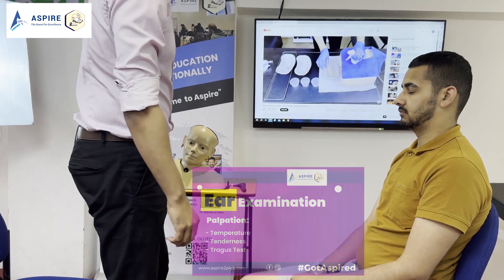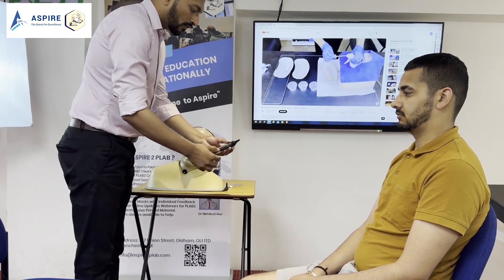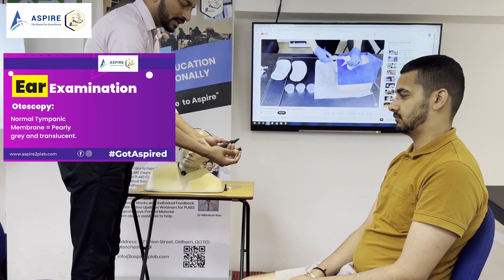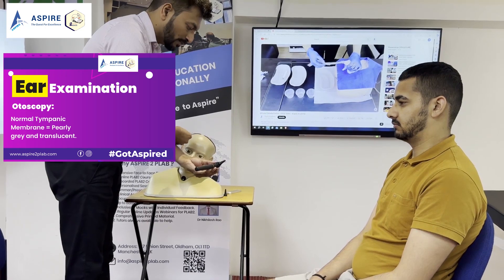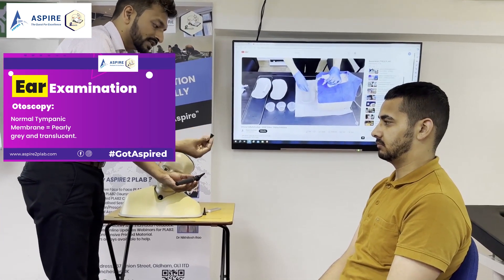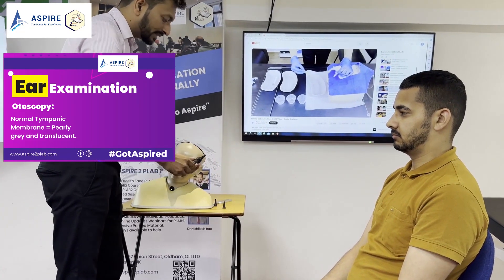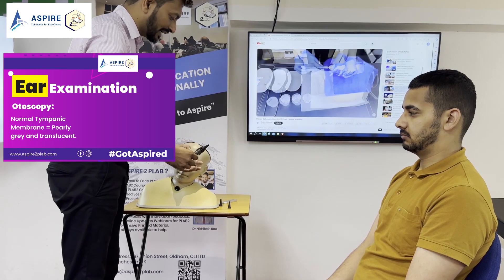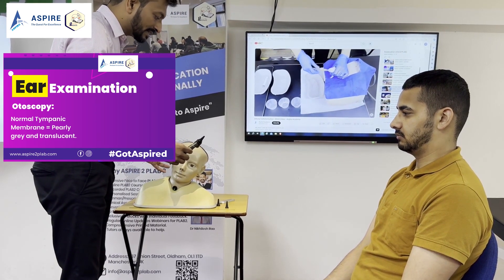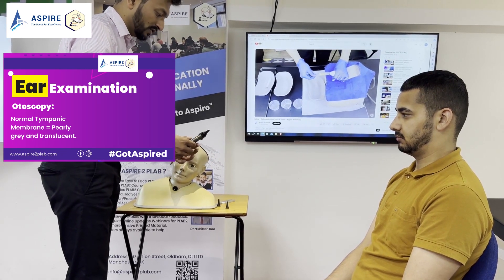Now we are ready for otoscopy. That is our otoscope. Make sure of one thing before you start the examination — have extra earpieces as well because we are going to check both ears, and after you are done with one ear, you are going to change the earpiece. Also, we will always start with the normal ear. For example, if my patient's right ear is abnormal, I am going to start with the left ear first.